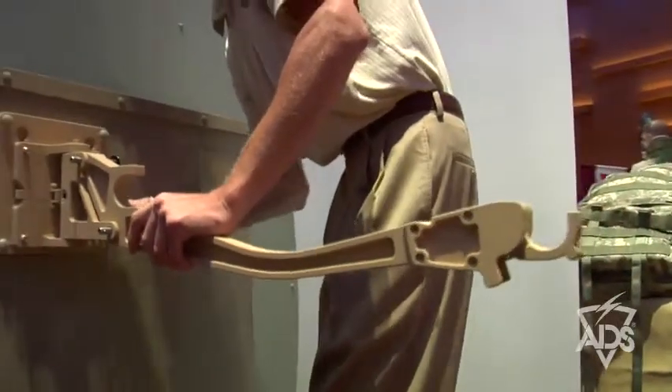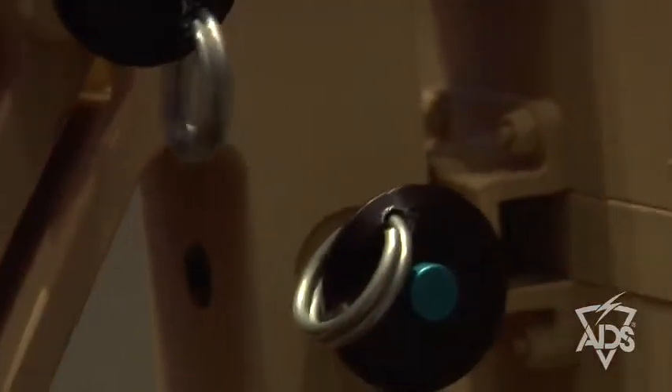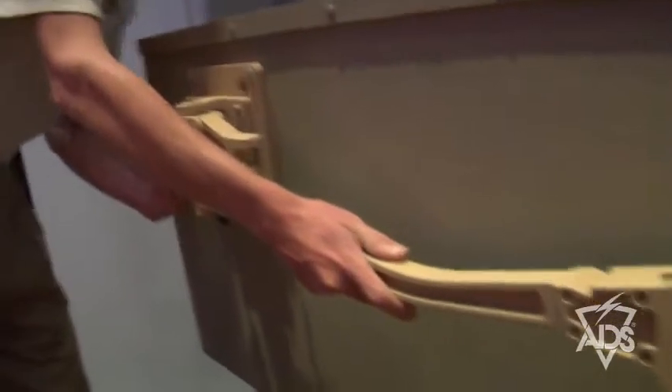The arms attach to the universal plate and remove easily. While attached, they fold flat or come out to a 90-degree angle. The system fits a range of litters.